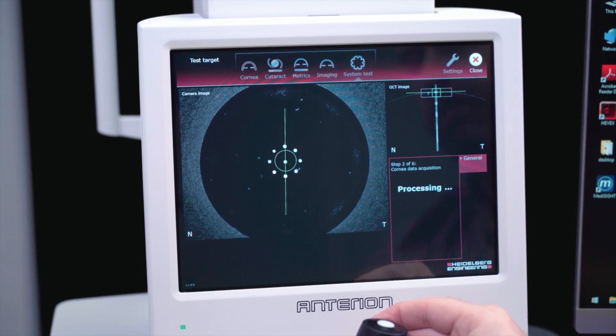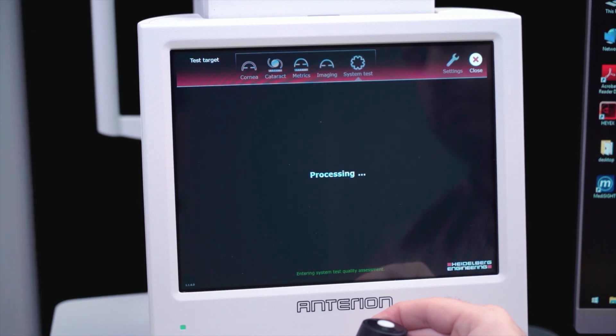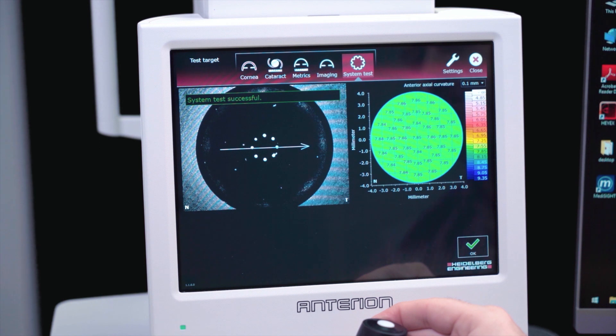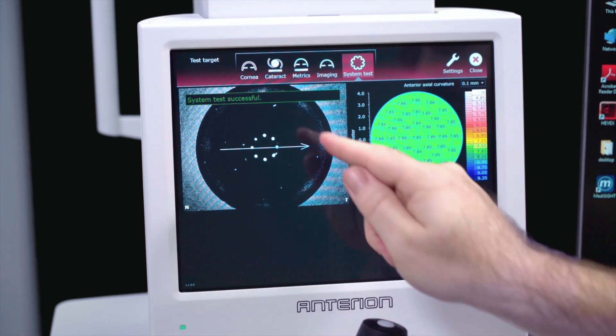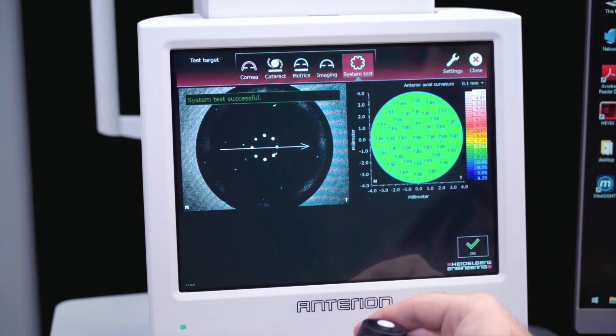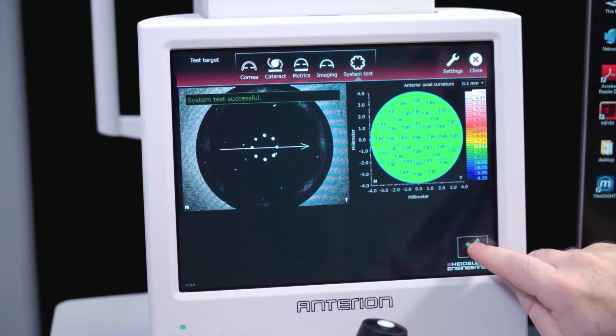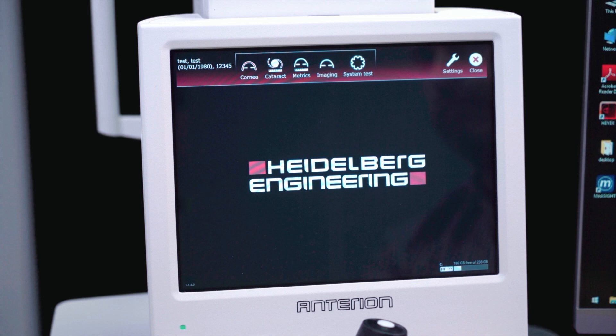The device will automatically go through six steps as part of the system test. If the system test was successful, press OK in the lower right corner. If the system test failed, please consult your Anterion user manual.